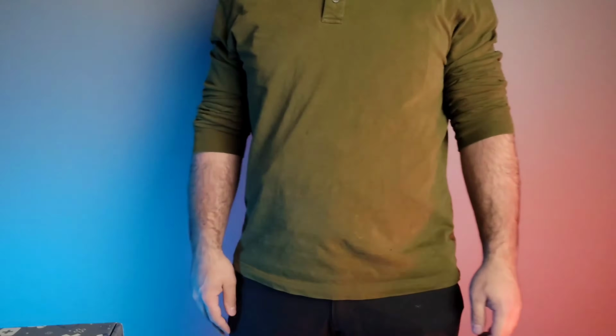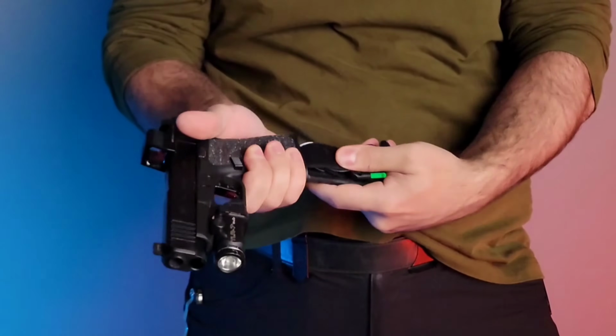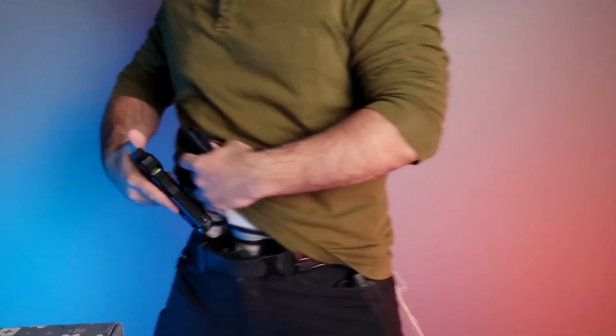The first thing I'll tell you in regards to carrying it: although it's able to fit into a magazine carrier, and I'm sure they're not advertising it this way, just be aware, it doesn't mean it should be there. The reason I'm saying this is that if your muscle memory is to have your magazine on your left and your firearm on your right, you don't want it in a location where you'd commonly reload from, because if you pull your tourniquet instead of your magazine, that's obviously a very bad situation to be in.